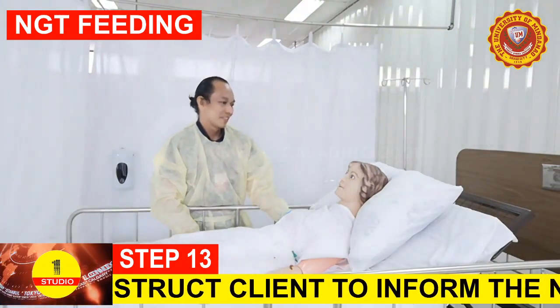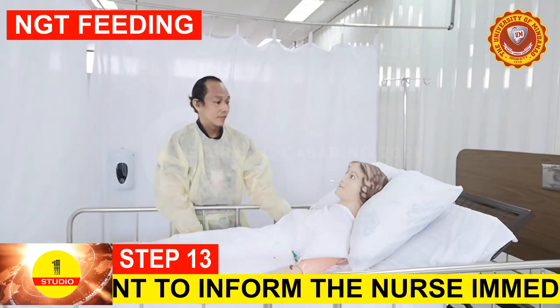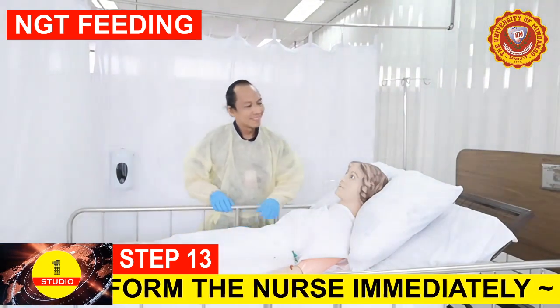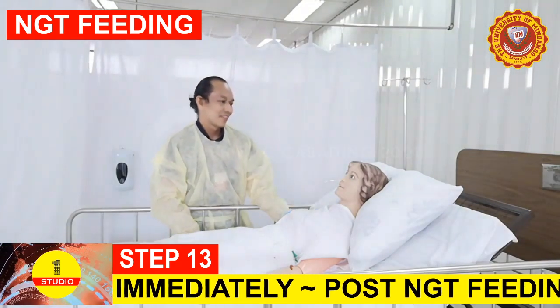Step 13. Instruct the client to notify the nurse if there are signs of feeding formula intolerances, such as nausea, vomiting, diarrhea, and abdominal pain.